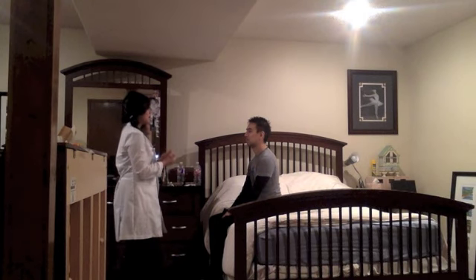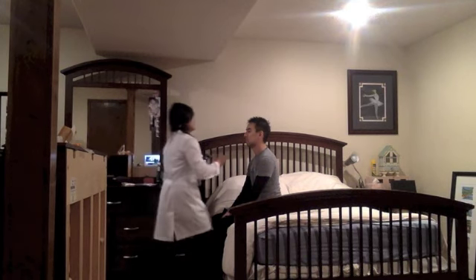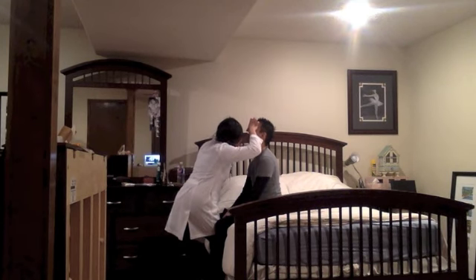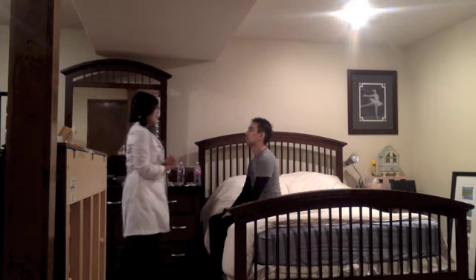Back to his nose, I'm going to look with my otoscope again. Tilt your head back. Okay. His nasal mucosa is glistening and pink. I do see some hair, which is okay. In the turbinates, there's no swelling there. The septum is midline. I didn't see any perforations, and there was no bleeding.